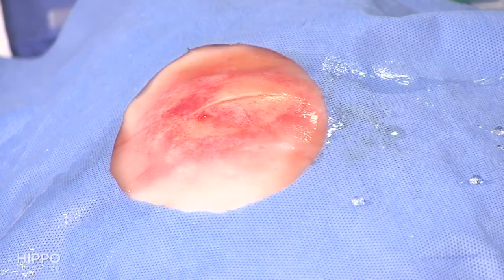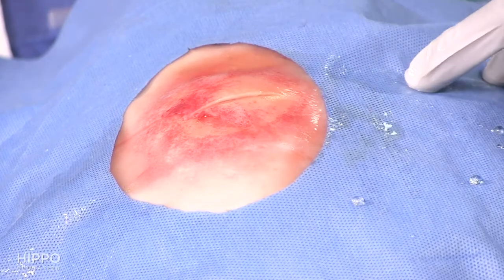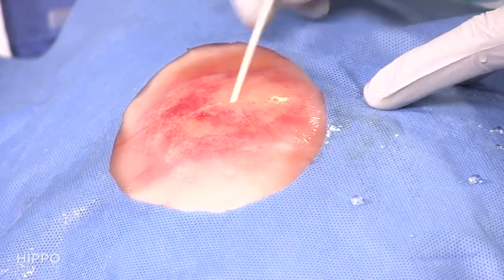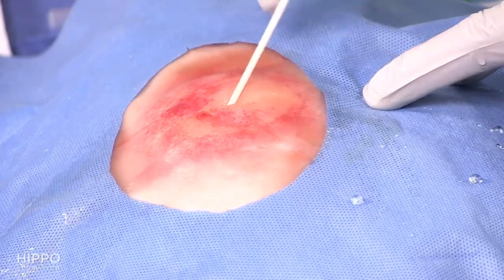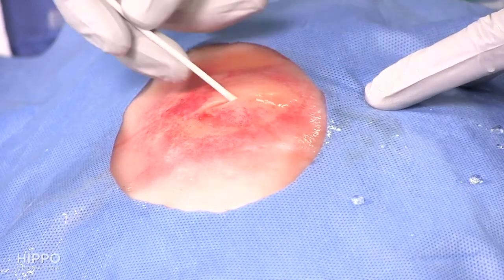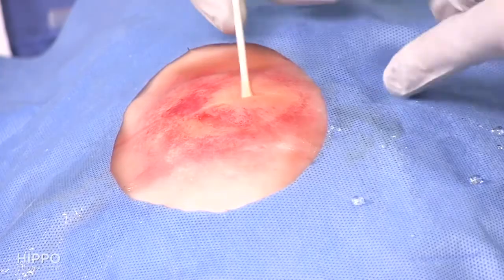So now that it's irrigated, I like to sometimes do one last step before I pack this, which is taking a cotton tip applicator. And again, you can kind of go back in here. You can do this with your blunt forceps if you want. But I'm just, again, feeling and making sure there aren't any residual pockets after I've irrigated or large pockets of pus that still need to be drained. And you can see there's pretty much, I'm feeling the edges of my abscess. There's no deeper tracks, and I'm not getting a whole lot of purulent material coming out.